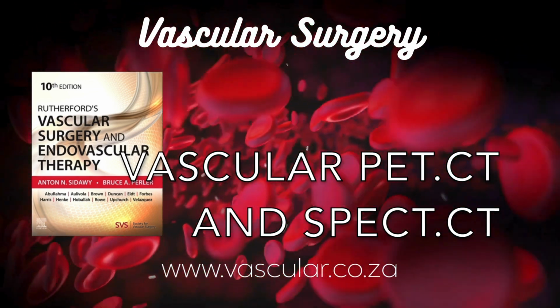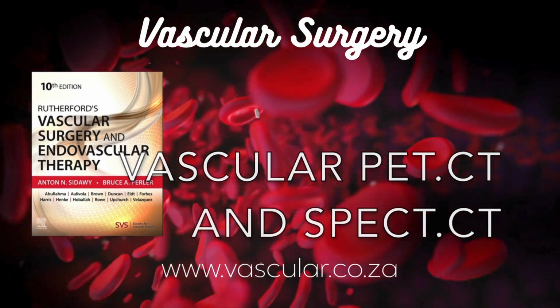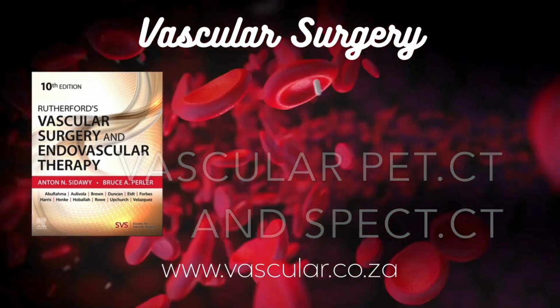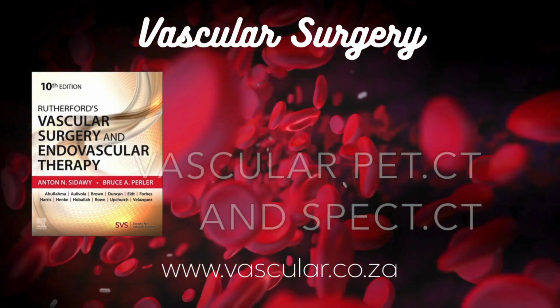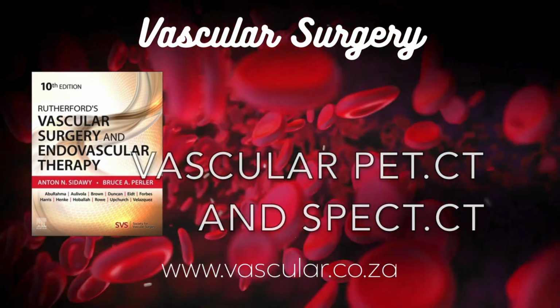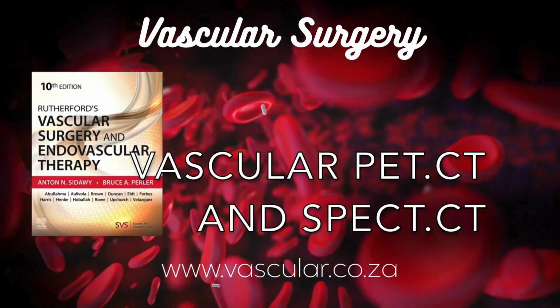Exactly. And it's brilliant because you get the best of both worlds. You see the functional abnormality and exactly where it is anatomically. That must really boost diagnostic confidence. Immensely. Improved sensitivity, you can spot subtle uptake in small structures. And specificity, the uptake is actually in the structure you care about, not just nearby. Plus, it's convenient for the patient, one appointment, and ensures the functional and anatomical data are perfectly aligned. Might even reduce overall costs sometimes.